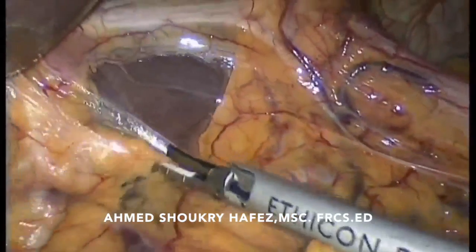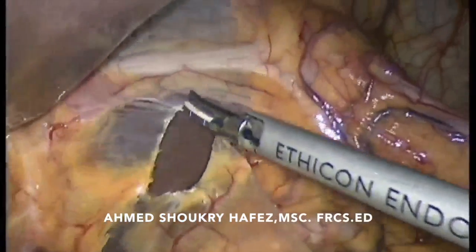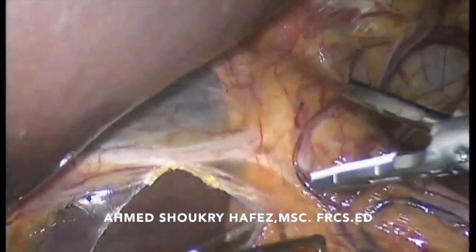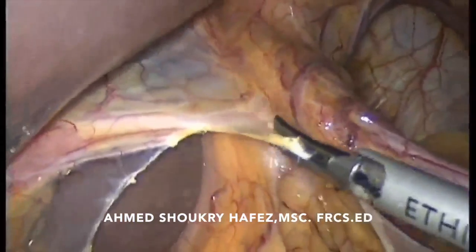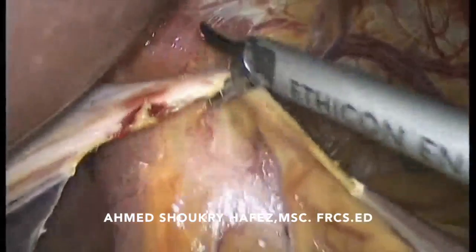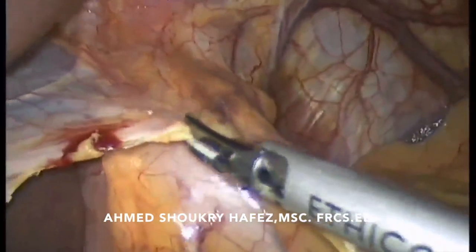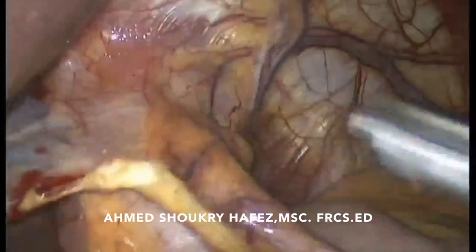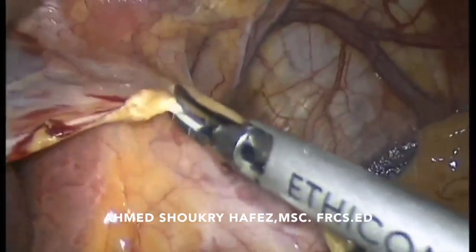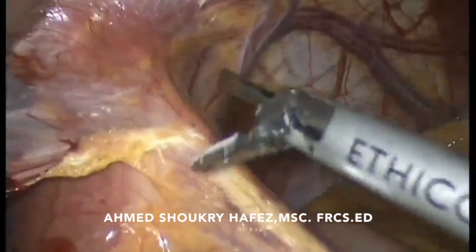Why we chose to do Toupet fundoplication instead of a Nissen fundoplication is that the patient has an almost aperistaltic esophagus. He has severe reflux and hiatal hernia, as you have seen, and also an almost aperistaltic esophagus with very weak peristalsis. This is why we resorted to a partial 270 degree wrap instead of a 360 degree, complete wrap, which might cause the patient dysphagia.